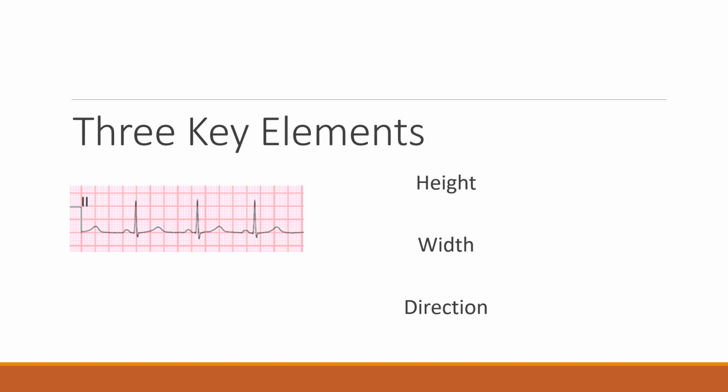That's why if you've ever noticed some of your patients when they're in distress, maybe they're hypotensive, they're shocky, their endogenous catecholamine response is surging, you may have noticed that the QRS complexes get bigger, and then as they start to feel better, they start to go down. Well, that's just because the heart was more excited and it was beating more forcefully, perhaps. It was producing more electrical energy, and the ECG received that.